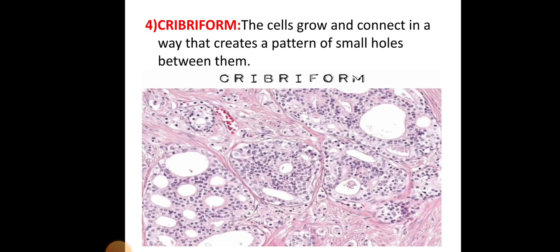The cribriform pattern is where the cells grow and connect in a way that creates small holes between them. This is most commonly seen in adenoid cystic carcinoma.